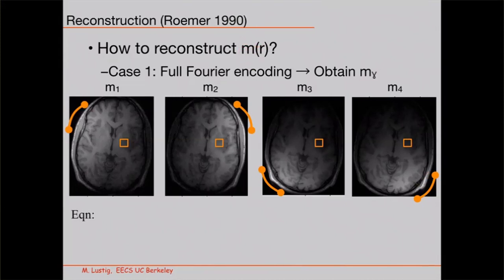the original magnetization image, without the coil weightings. What is the best way? One way you could do it is to say, let's think of the forward model, the model by which the image is acquired. Let me pick a color. Let's do black.